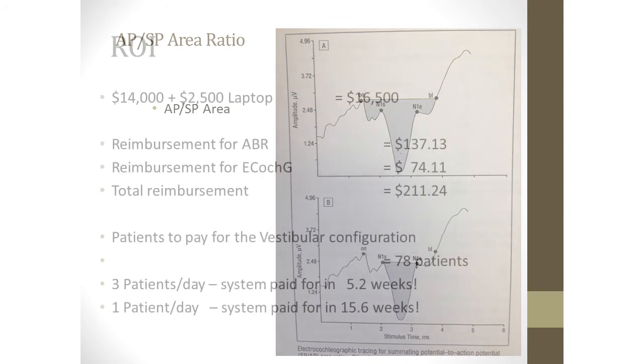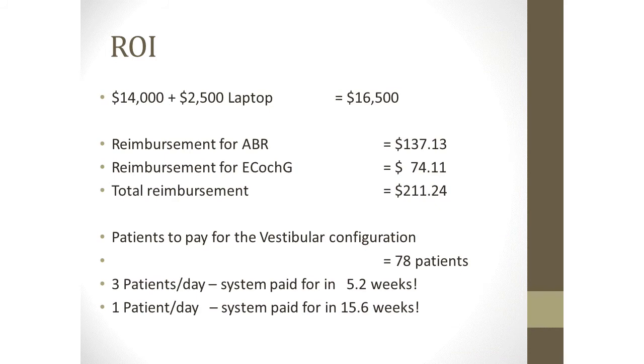All right. I put this slide up here. ROI is return on investment, right? Interacoustics and their Eclipse. Eclipse is the model of their auditory evoked potential system. This particular version of the equipment would be if you were testing really all adults and doing adult ABRs, ECOGs, and VEMPs, cVEMPs and oVEMPs, and you just wanted it configured like that, all right?